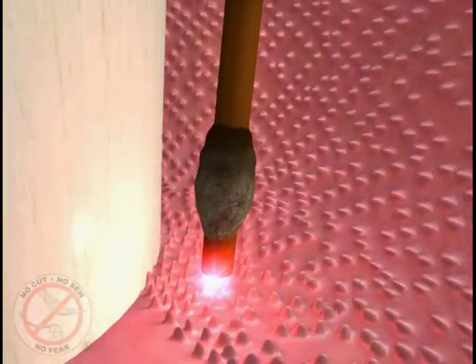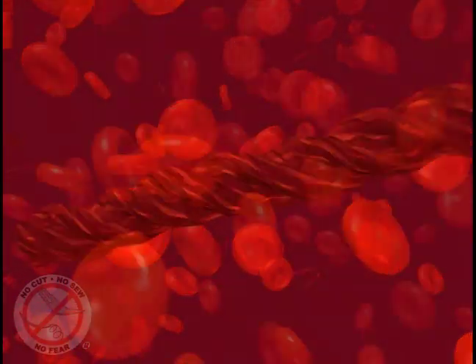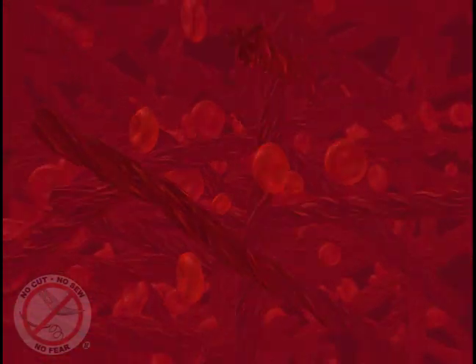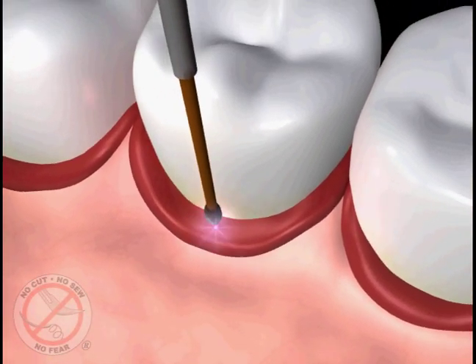It also stimulates the formation of a blood clot, which once formed contains fibers that reattach your tissue to the tooth surface and seal out debris and bacteria like stitches would, creating the right environment to cause the bone and other soft tissues lost from the disease to grow back.